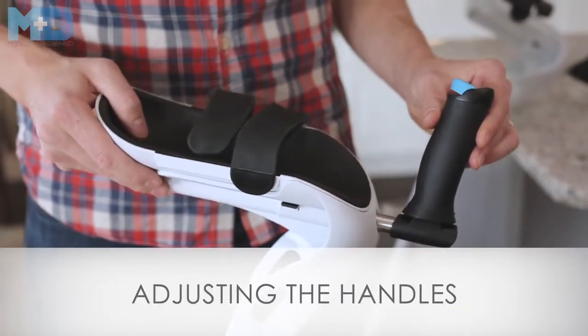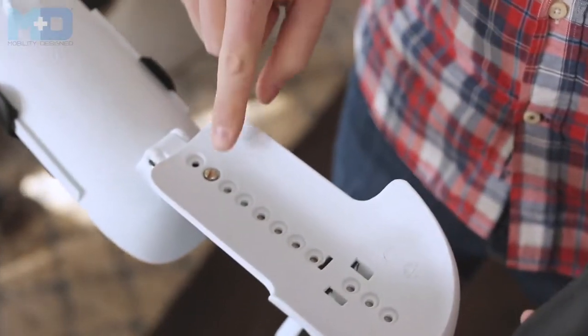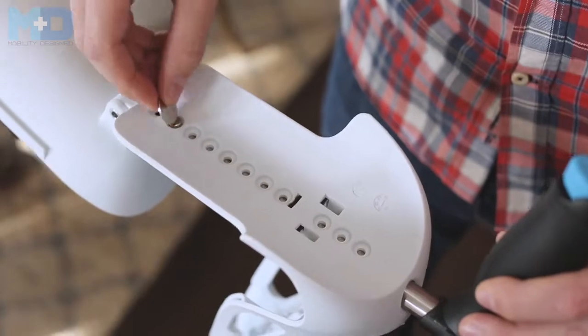To be able to access the adjustment screw for the handle, you have to rotate the cradle up. To adjust the screw or take the screw out, all you need is a coin or a screwdriver.